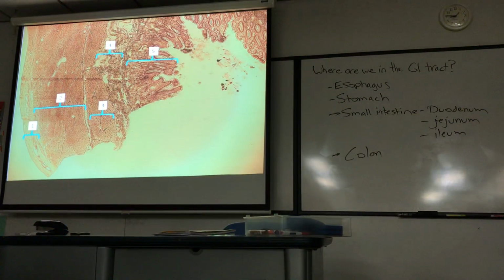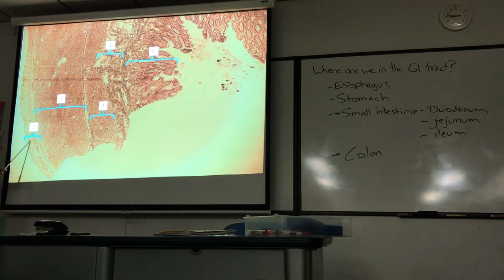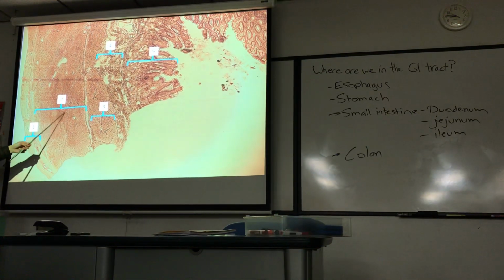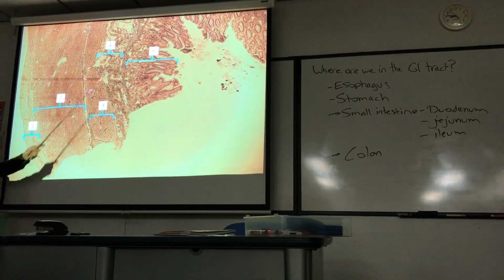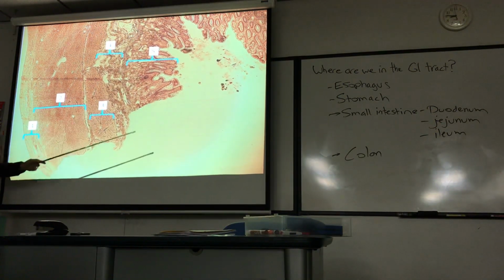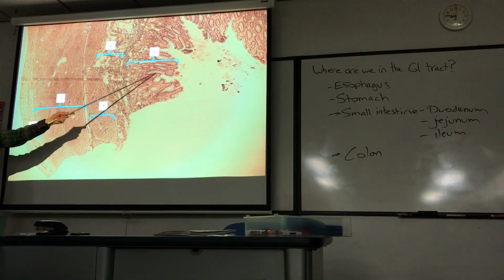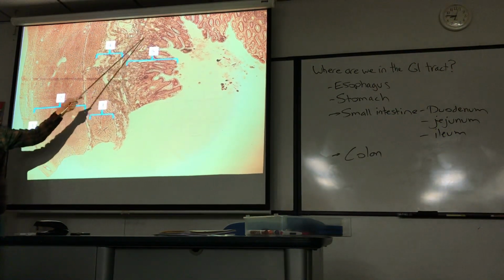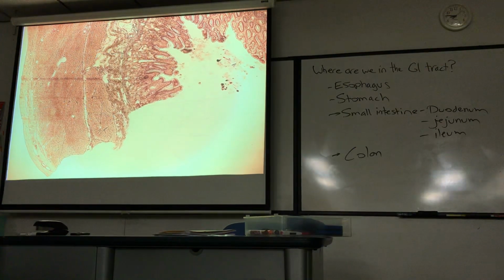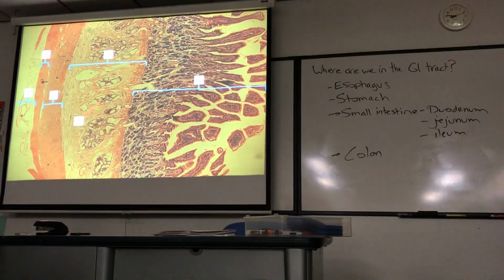This is still stomach. Okay. 1, 2, 3 is the tri-layered muscularis externa. Longitudinal, circular, oblique. Once again, longitudinal, circular, oblique. Number 4, submucosa. Number 5, mucosa. Now, I didn't point to it, but if I pointed to a pit, that's it. And these little pits on the surface, and deeper in would be the gland, the gastric gland. Okay. So that's stomach.